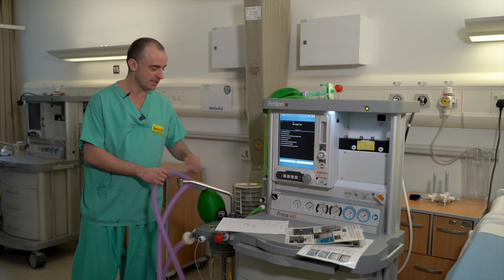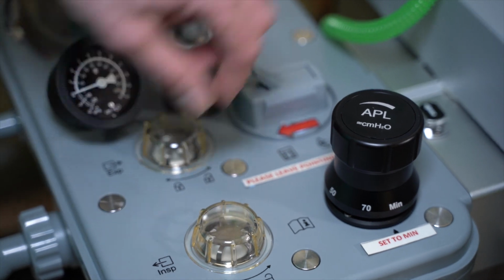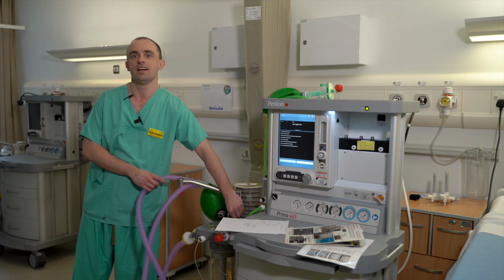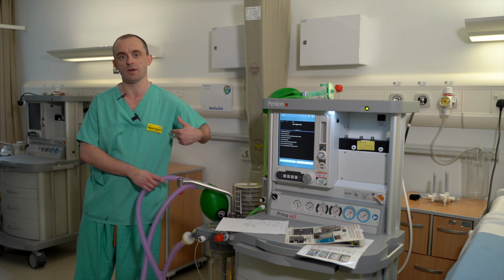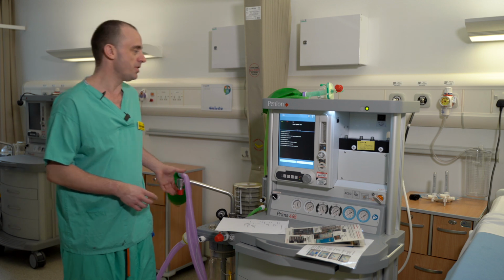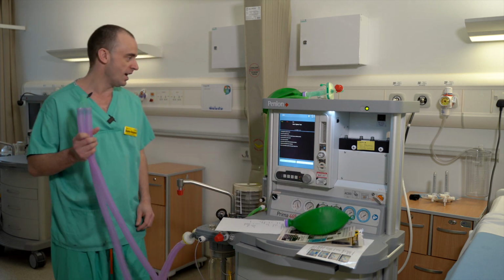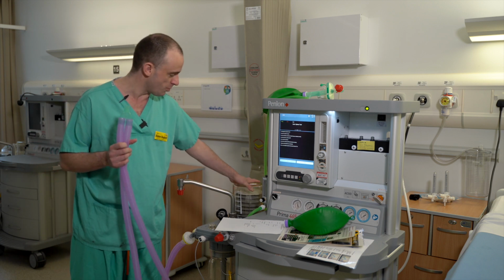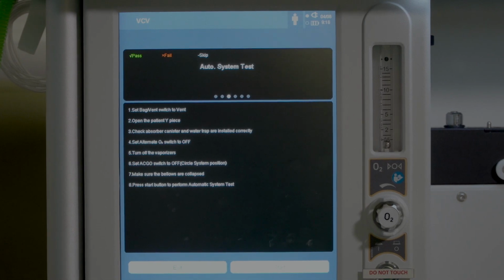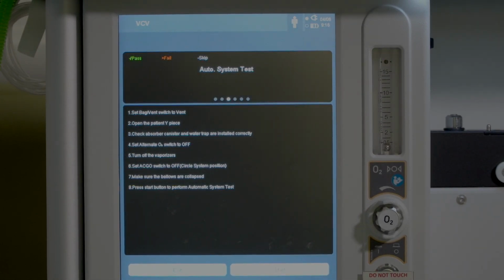Just here is a switch next to this brown dial. This has an arrow on it which points the direction it needs to be, but essentially there's a picture of a ventilator, and this switch needs to point this way towards the ventilator. Having done that, you need to open the patient's Y piece, so I'm going to take away my patient's lung. And we're going to check that the absorber canister, which is here, is fixed, but also that the ventilator bottle is also fixed and not loose, because both of these are sources of leak.